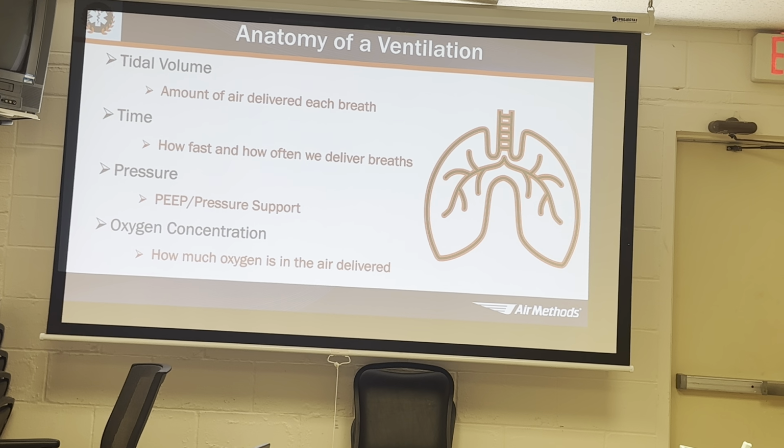PEEP, or pressure, I should say. PEEP is just a constant, right? It keeps our alveoli open and helps us recruit lung tissue that may be closed off. And then pressure support is the pressure we give to make that breath, right? So PEEP stays constant, pressure support is when we take a breath or give the breath, and then we exhale passively on the ventilator. And then oxygen concentration, we'll talk about the FiO2.